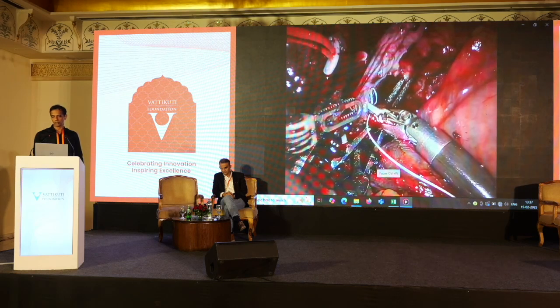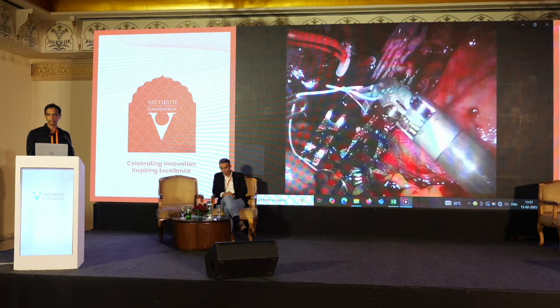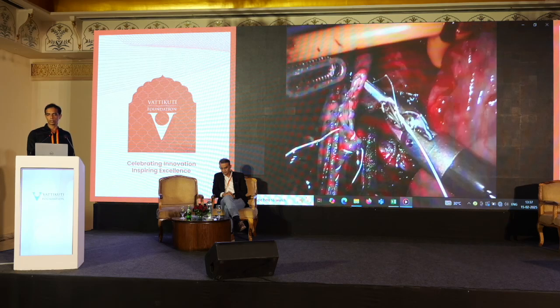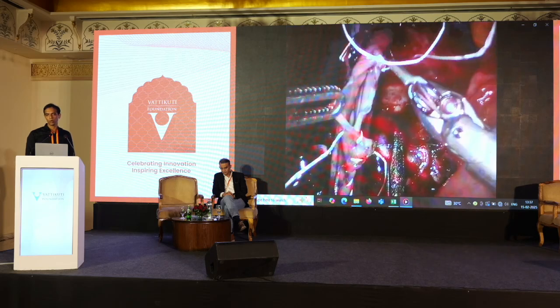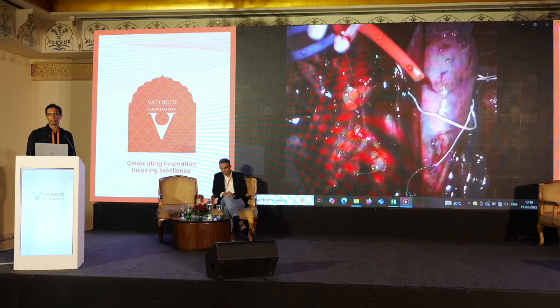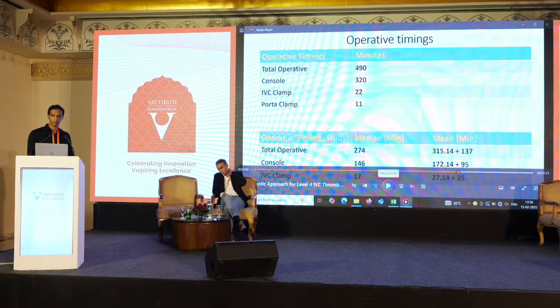We generally suture with CV5 TTC9 Gore-Tex suture. This is very easy to handle. We also flush with heparin. We use a suture from below and a suture from above and tie it in the middle to avoid the bursting effect. And we also confirm the watertight closure. After that, all the clamps are released. Before suturing, we release the suprahepatic clamp and apply the clamp in the suprarenal part.